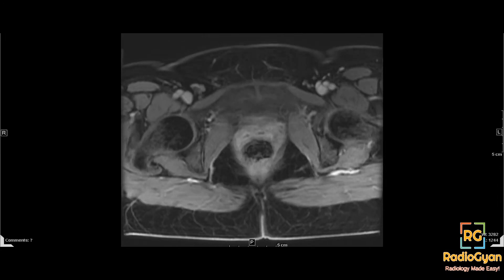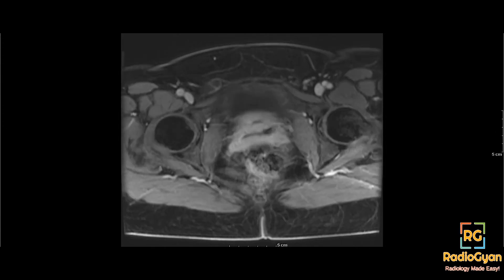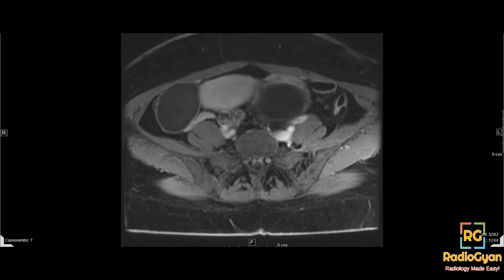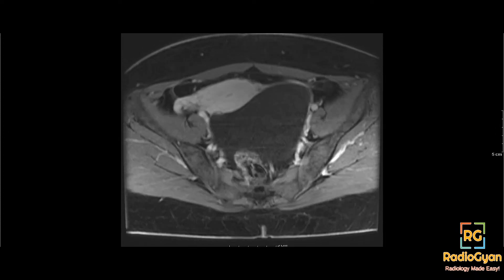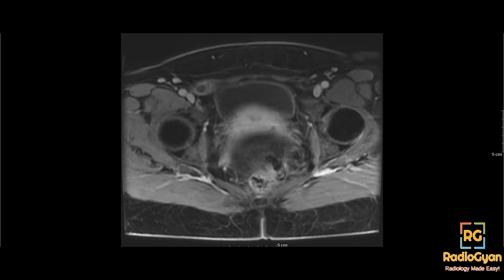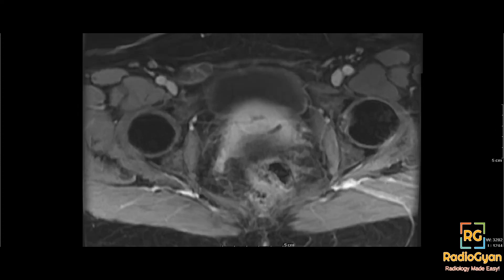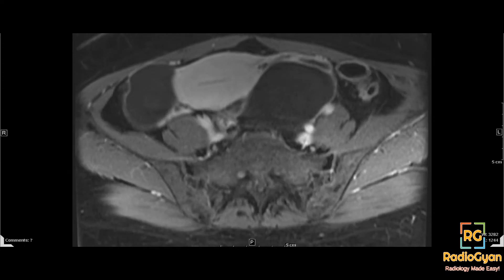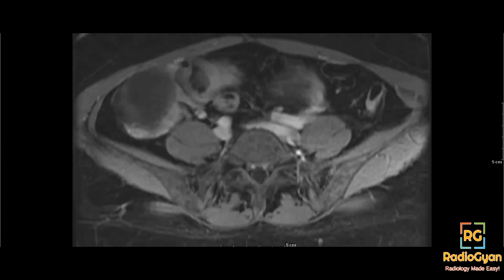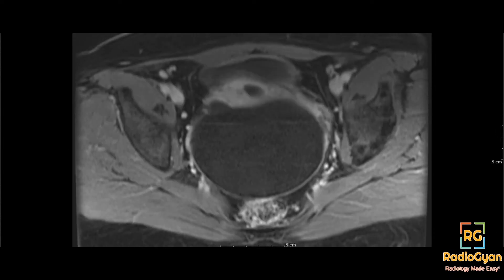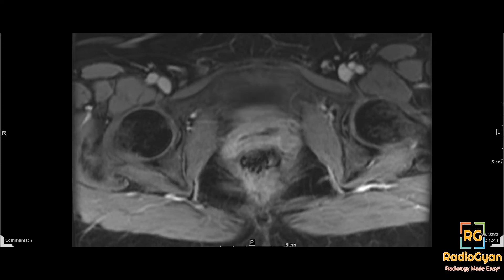Although in the ovaries, we typically do not see inguinal nodes because that's not the drainage pathway — but that's what I initially thought. Dr. Marwa suggested a herniated ovary, which would be unlikely because we do see the adnexal lesions here, and if we trace the ovarian vessels, they lead up to the right ovary in place. Endometriosis is also a good differential, although it would be very atypical in that region.